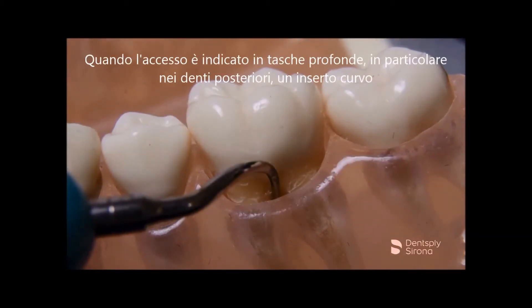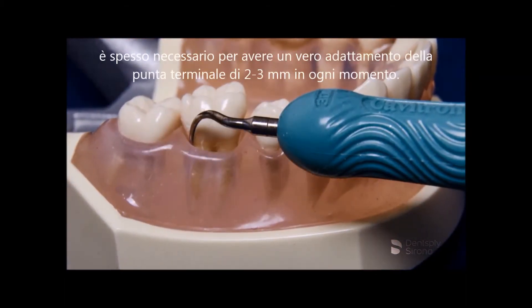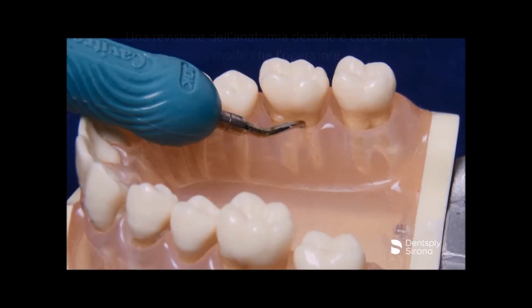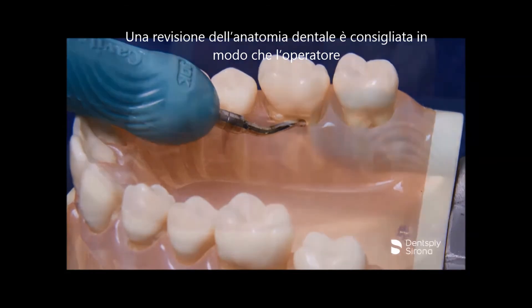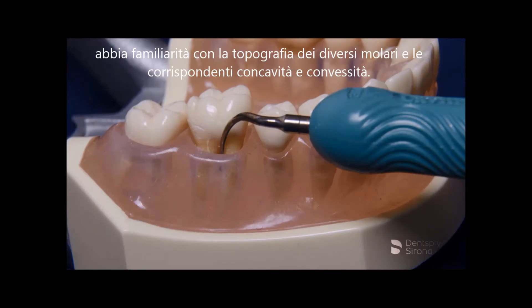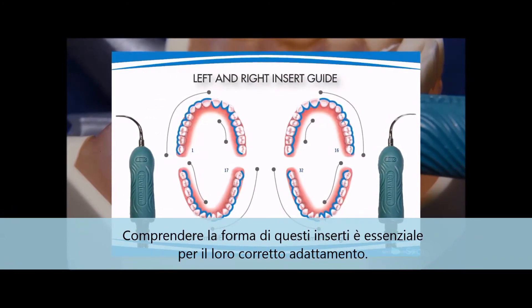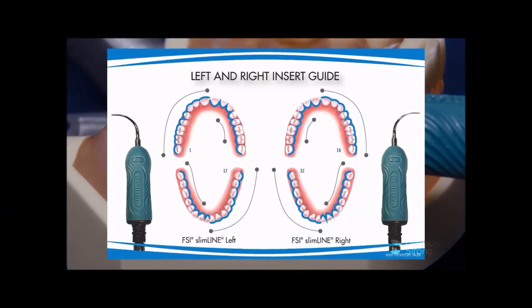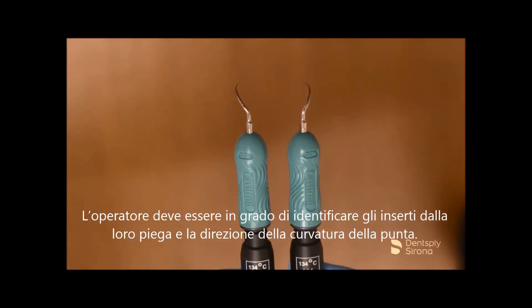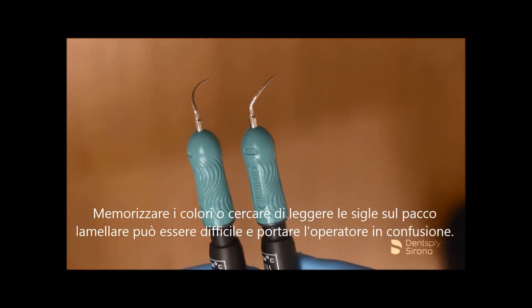When access is indicated in deeper pockets, in particular the posterior teeth, the curved insert is often necessary to maintain true adaptation of the terminal 2 to 3 millimeters at all times. A review of dental anatomy is recommended so the clinician is familiar with the topography of the different molars and the corresponding concavities and convexities. Understanding the area-specific design of these inserts is essential for proper adaptation. The clinician must be able to identify the inserts by recognition of the shank and direction of the curvature of the tip. Memorizing colors or trying to read the stacks can be challenging and prove confusing for the clinician.